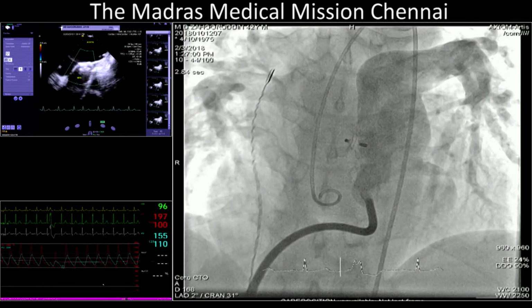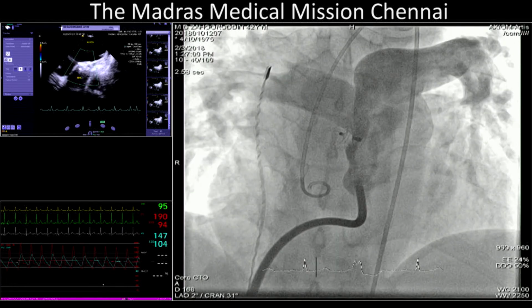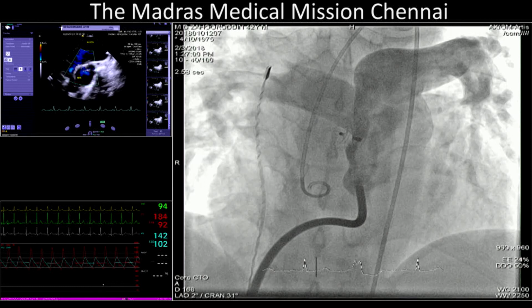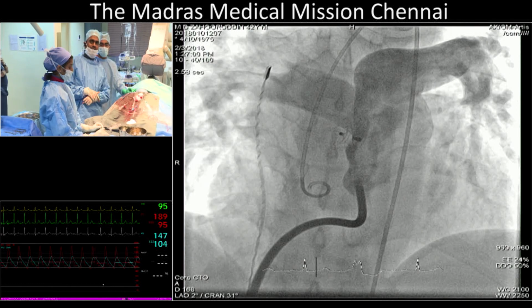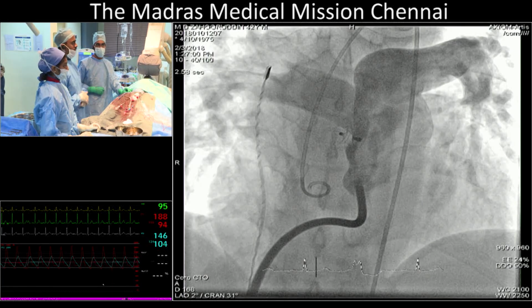Congratulations. What was your procedure time now with preparing all? So it is not so easy. Operative lesion. I think we're going to go for a lecture now. Go for variant of a truncus, the common trunk. Yeah, you go for the lecture. I'm having a paravalvular leak on echo navigation, which I will show once you are giving us a slot in between. You go for the lectures right now.